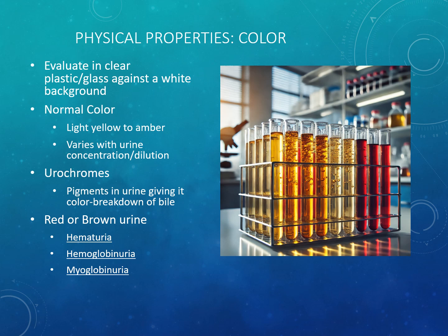When you spin down a sample like this, the supernatant may appear straw colored, and all of the red blood cells will be down in the sediment plug. So it's important to evaluate the urine before it is spun down. Hematuria is usually caused by trauma, hemorrhage, inflammation, presence of stones, or cancer. It can also be a symptom of UTIs or more serious disorders like urinary tract cancers. However, again, the most common causes are usually UTIs, stones, and crystals.